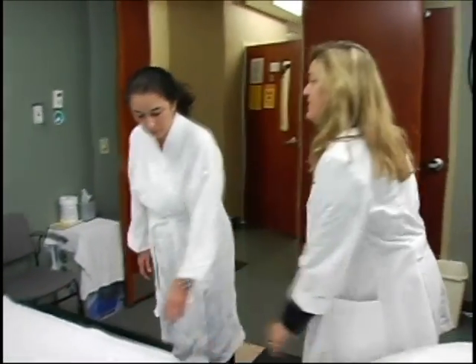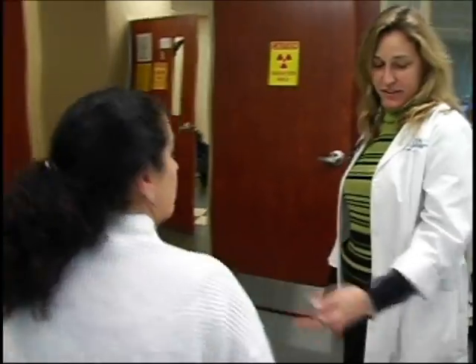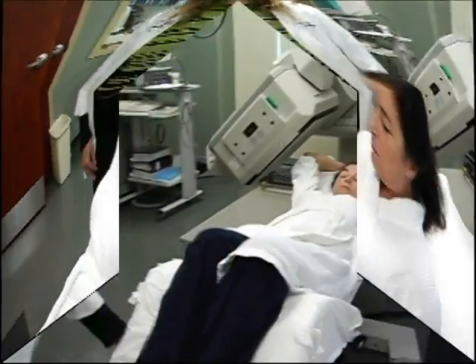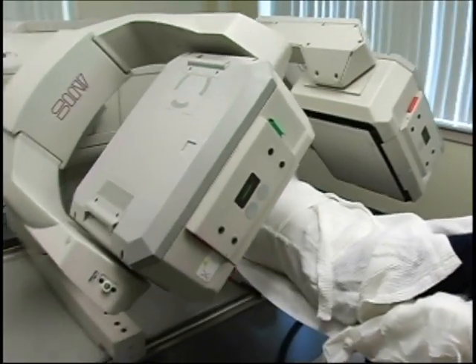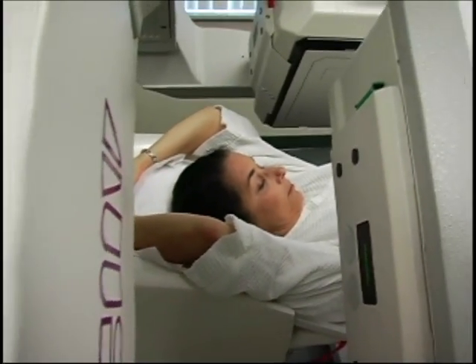To begin the images we will have you lie down on a table with your arms above your head. The imaging camera will move slowly around your chest for approximately 15 minutes.